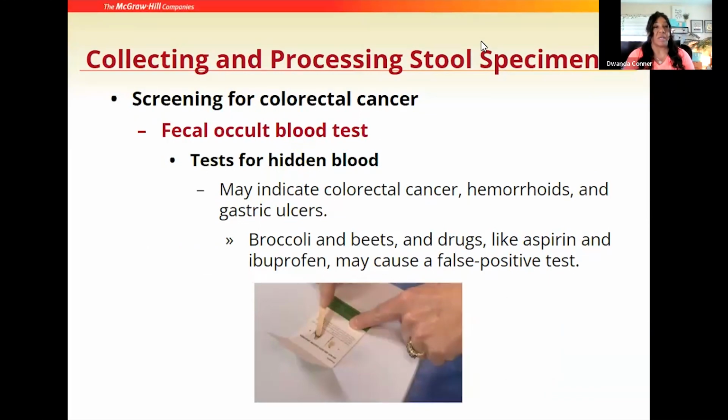The test is a fecal occult blood test, and it's a test that is looking for hidden blood. So this isn't blood that we're going to visually see in the stool, but it is blood that the test can identify that is hidden within the stool.